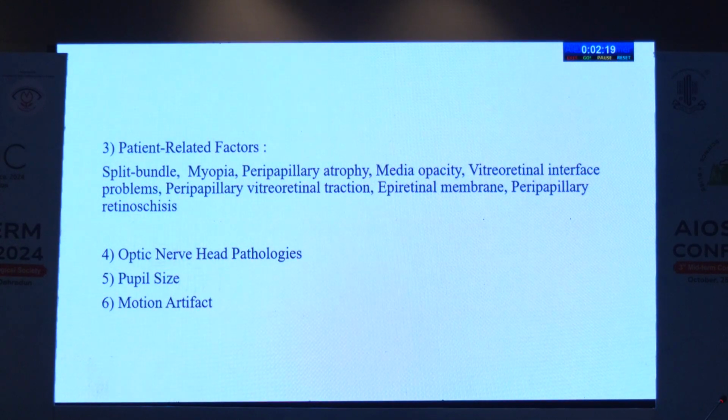And there are some patient-related factors like split bundle of the optic nerve head, myopia, peripapillary atrophy, media opacity, vitreoretinal interface problems, peripapillary vitreoretinal traction, ERM, and peripapillary retinoschisis. Optic nerve head pathologies and pupil size and motion artifact will also impact the BMO measurement.